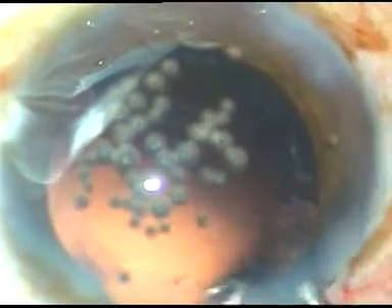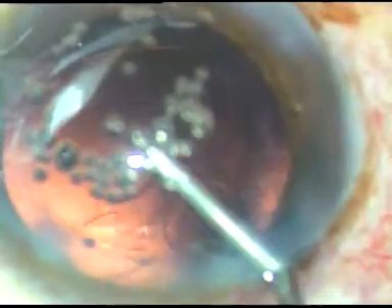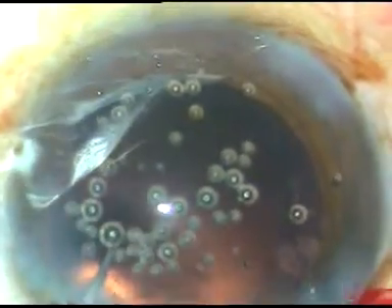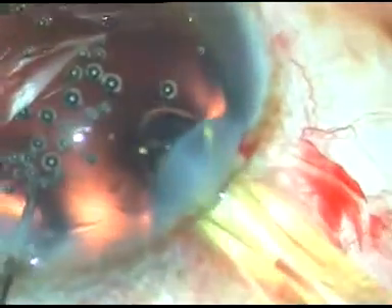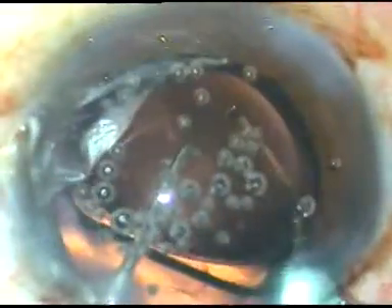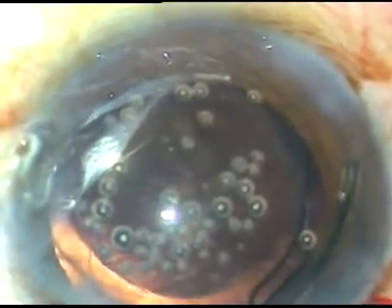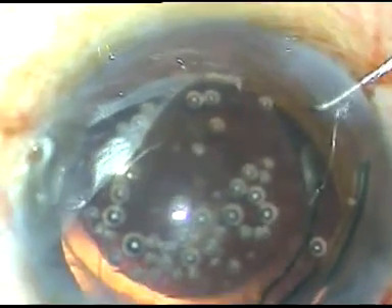This is the viscoelastic substance, and this is the intraocular lens. It is a Superfove lens marketed by Appasami Associates — a nice lens that unfolds very quickly.